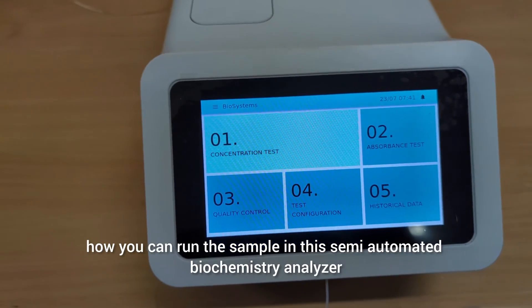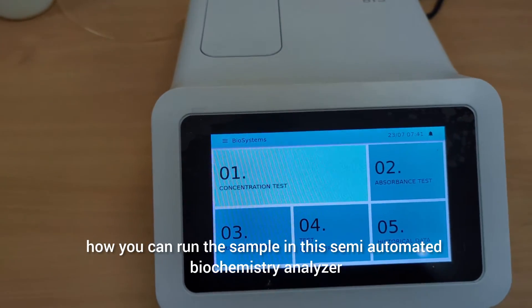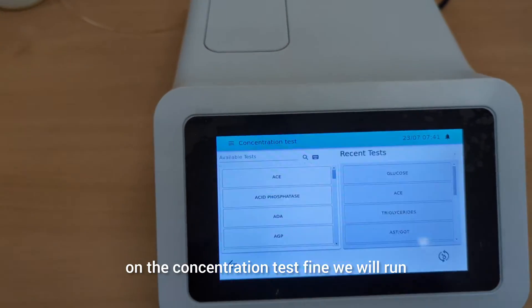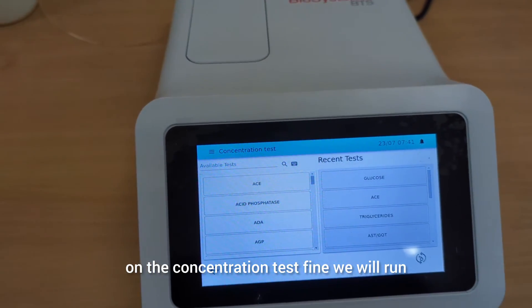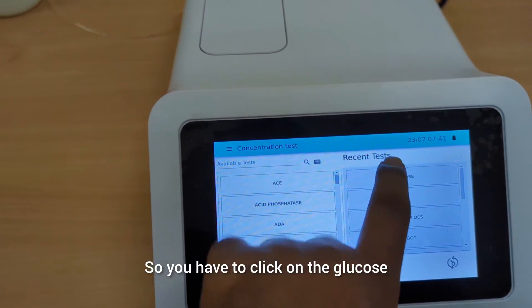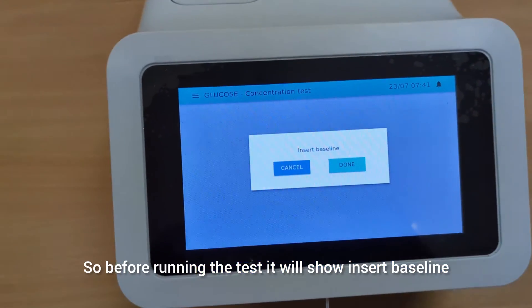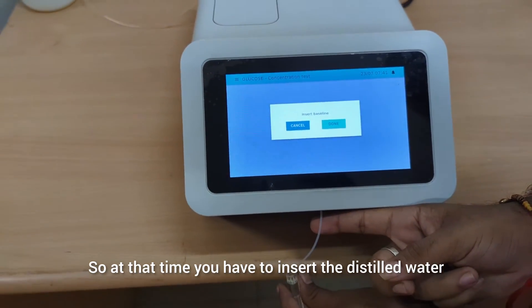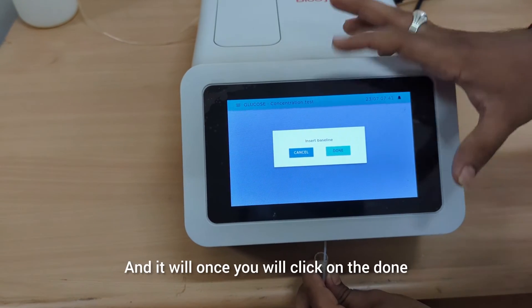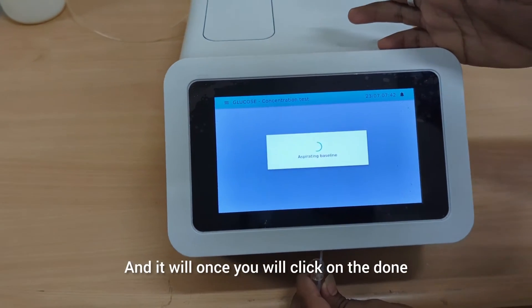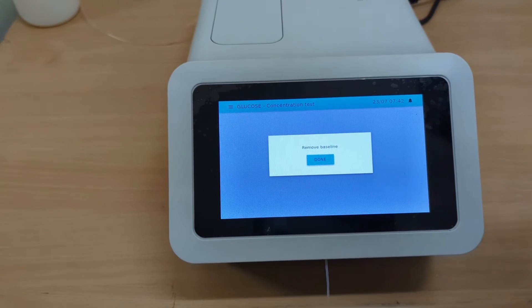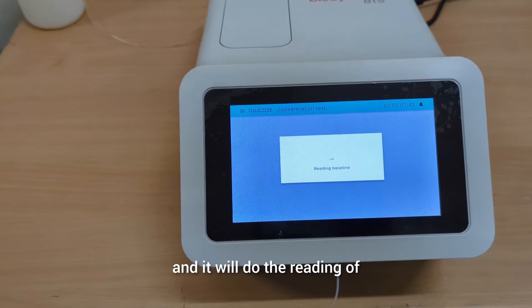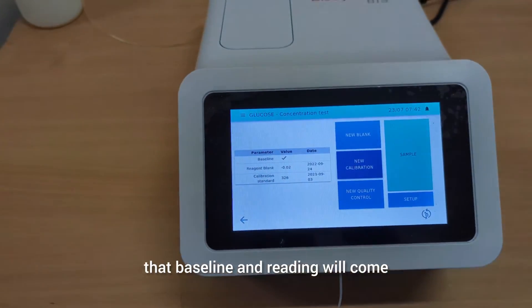Now we will see how to run the sample in this semi-automated biochemistry analyzer. First, click on the concentration test. We will run the glucose test, so click on glucose. Before running the test, it will show 'insert baseline,' at which point you insert distilled water. Once you click done, it will automatically aspirate the sample, then a message will pop up to remove the baseline, and it will do the reading.